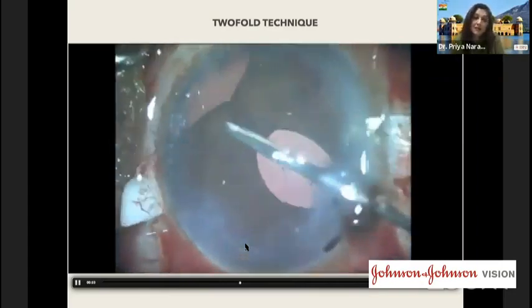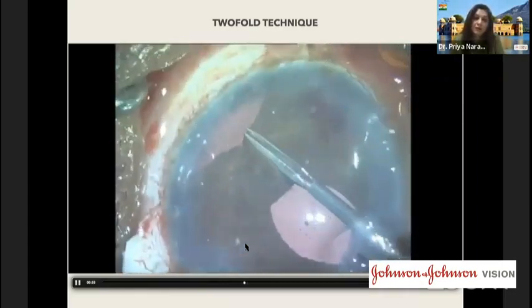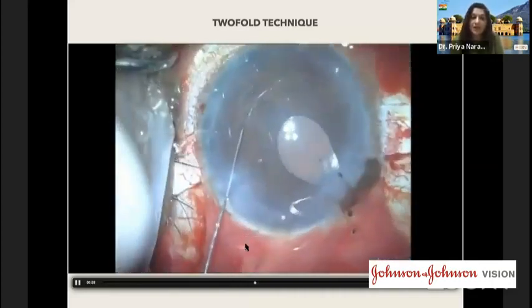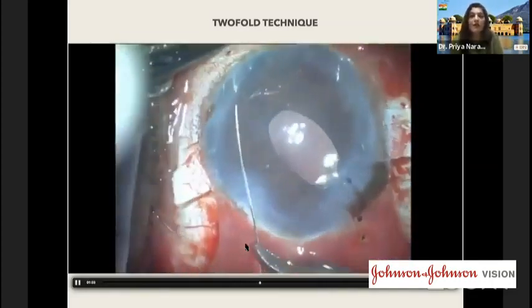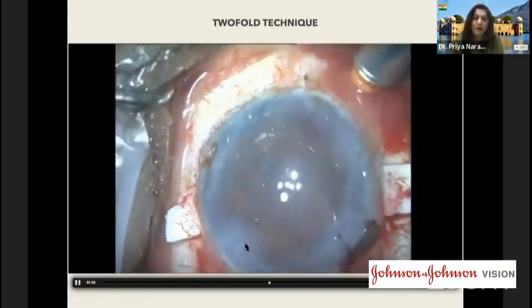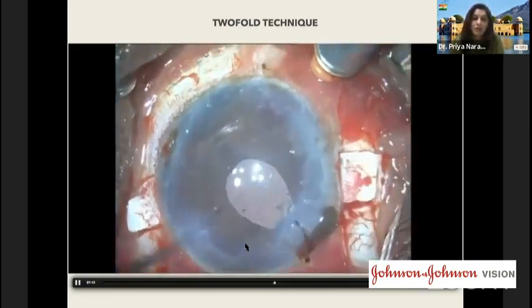So this is the same thing which I showed before in the animation. These are the micro scissors that go inside and you cut down the knot. And then you can go ahead with an inner suture. This is a non-oppositional repair as described, and this is again a double arm suture which is taken up.